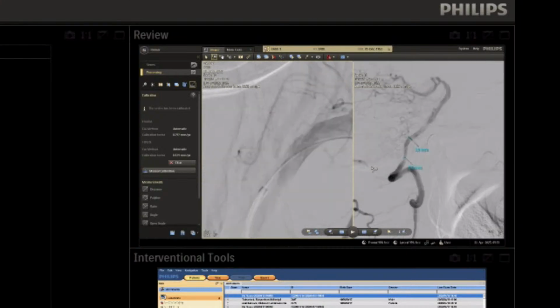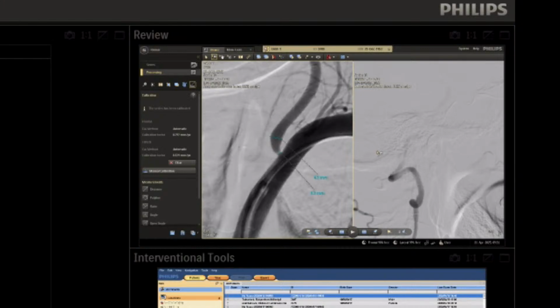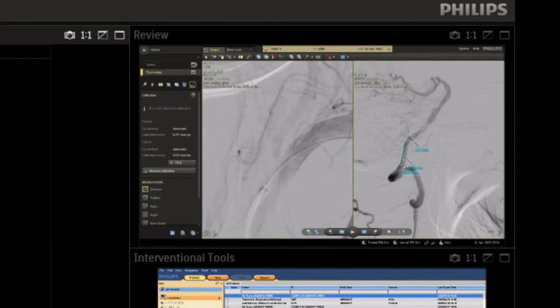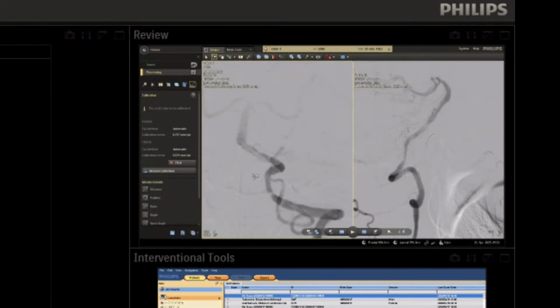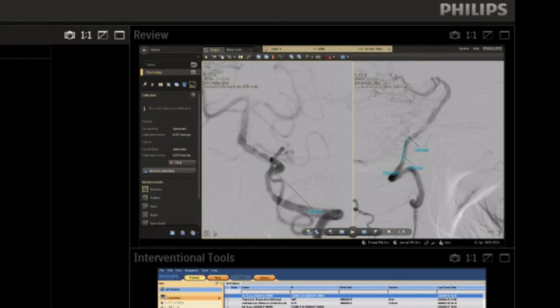V4 segment is also stenosis, and I think we need to stent minimum this part. V4 segment, I think we should stent, and we should stent right V4 segment also. Okay, I will measure the V4 segment on the right side. Distal V4 segment. Yes, it's completely ill patient.